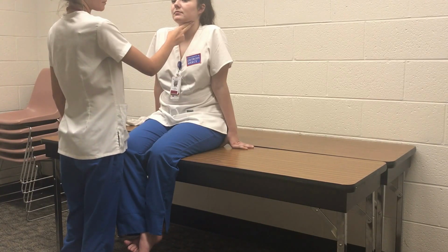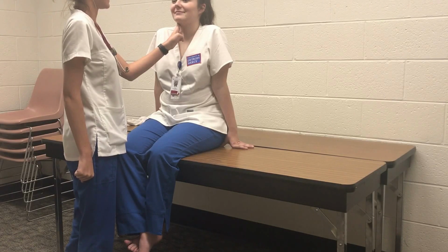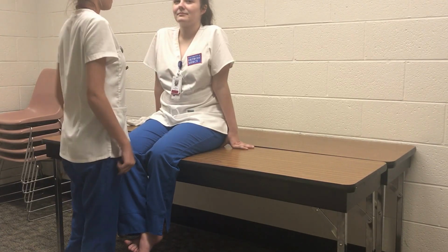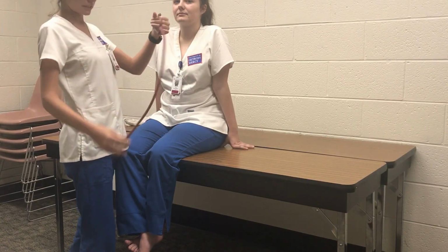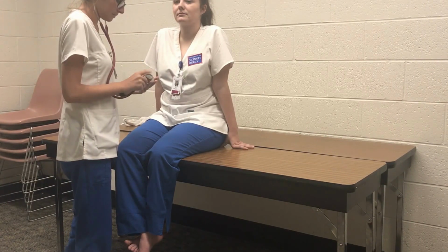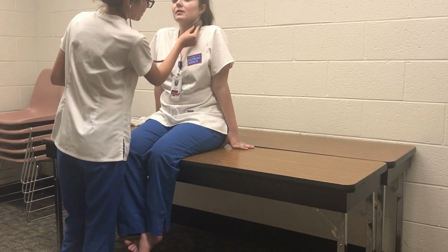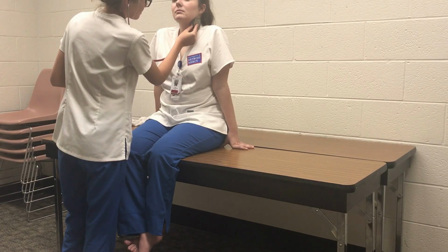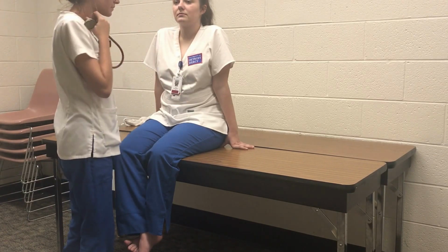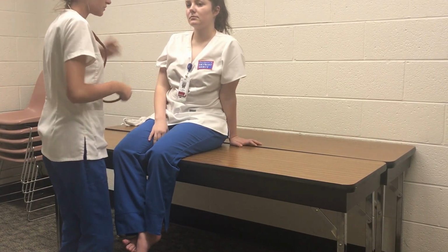I'm gonna palpate the carotid arteries. They're both 2+ bilaterally. I'm going to listen with my stethoscope, with the bell. All right. Hold your breath. Okay, and then hold your breath again. Okay, there were no signs of bruit, and I heard nothing. Now I'm going to move to your arms.